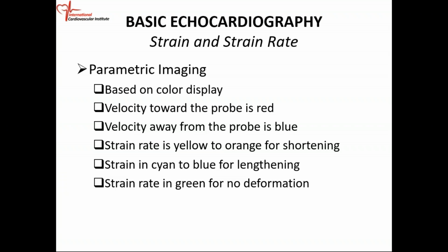But there's a method to the madness, just like when we do color flow Doppler, certain principles are followed. And it's basically the same principle.